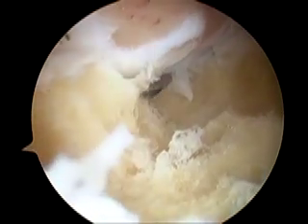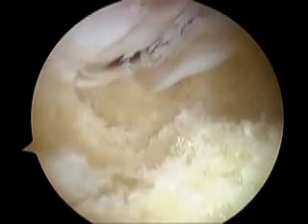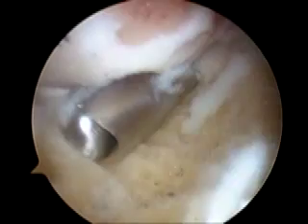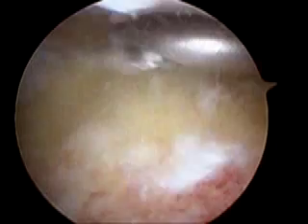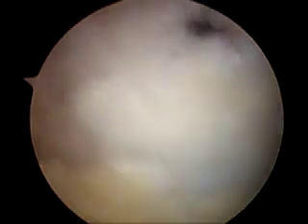And then we had to establish an alternative portal, as we are seeing now, in order to achieve a full resection of the radial head. This is a more posterior portal, a very safe portal, and through this alternative portal we could reach all parts of the radial head. Now we are finishing the radial head resection using a soft tissue shaver. This is the final part of the resection, still working from the new lateral portal. Now the radial head resection is almost finished, and now we are seeing the semilunar fossa from the lateral portal.